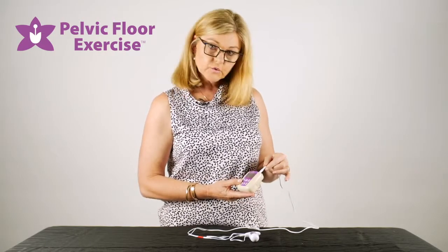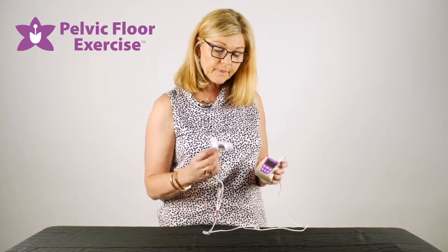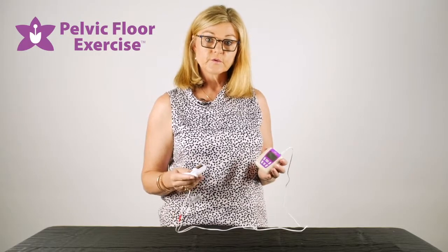You start by attaching your lead and then the lead to your electrode. Pop a little bit of water-based lubricant onto your electrode and insert it into the vagina.